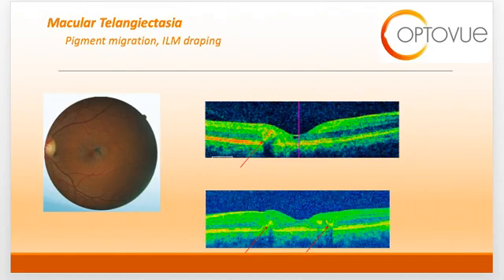As the disease progresses, the outer retina becomes involved. This slide shows RPE hyperplasia that occurs as a result of continued damage to the outer retina and photoreceptor layer. Hyperreflective areas on OCT correlate to RPE hyperplasia or pigment migration, as can be seen by the red arrows on this scan.